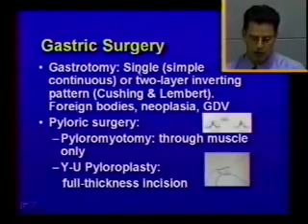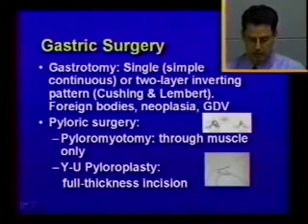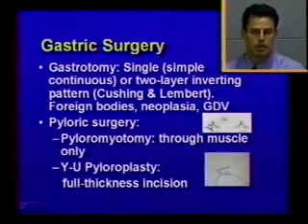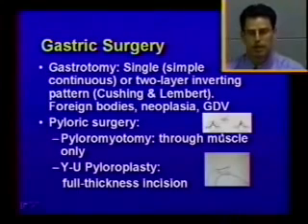We're usually going to do either a single or more commonly a two-layer inverting closure, and I'm not sure if you'll be able to make out these patterns here, but they are pictured in most of the surgery textbooks, where we're going to take bites before and then coming out before the incision and then exiting before we get to the incision, going over to the other side of the incision and then doing the same. So the end result is that the tissues invert, and this can be done either in an interrupted or continuous pattern.